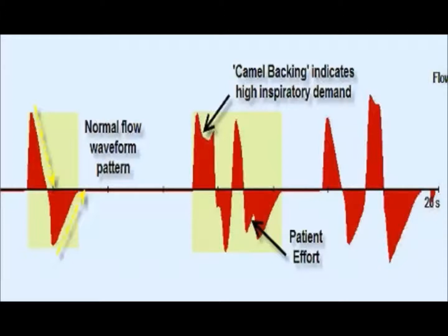So a peak pressure of around 15 to 20 centimeters of water is generally needed to provide a significant support if the goal is to minimize patient work of breathing. And you usually have a fixed level of pressure control. So when we ask if the mode can provide automatic adjustments, what the mode is actually doing during these high demands is the ventilator increasing the pressure control output to meet the demand.